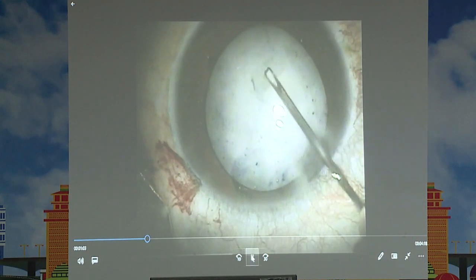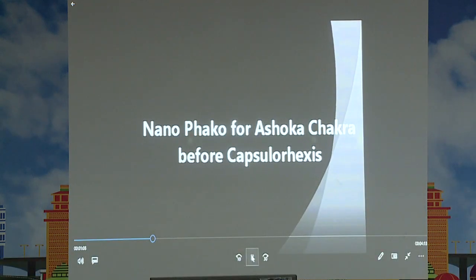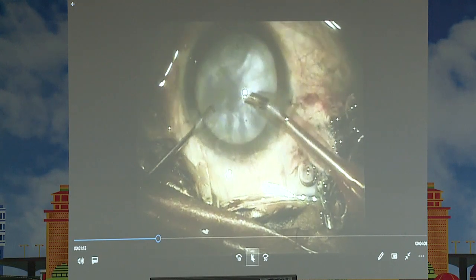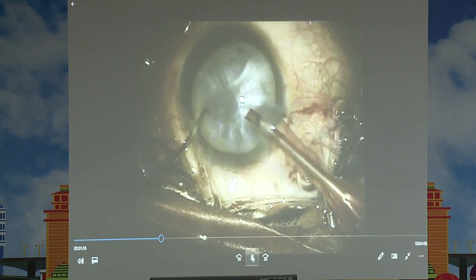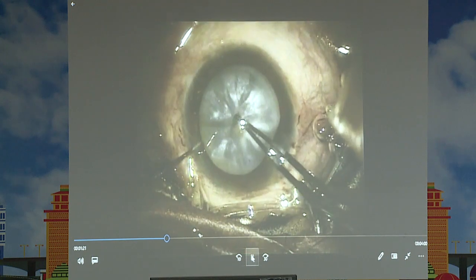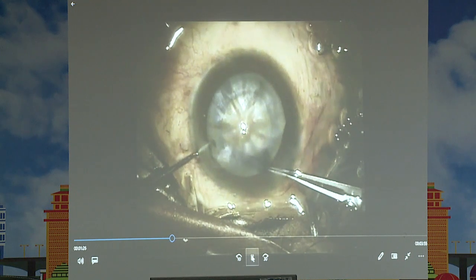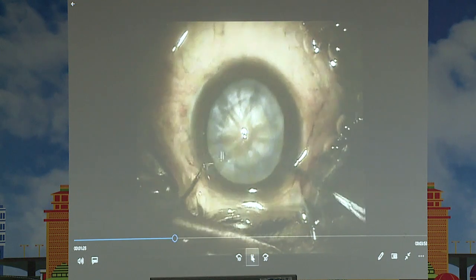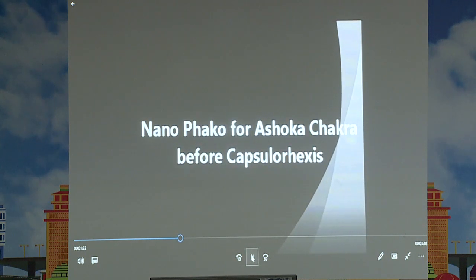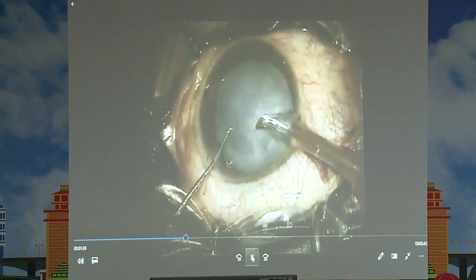You have to have the trypan blue. Another case. Give a punch. You don't have to come out immediately. In the last two clippings, I'll be sharing more details. So this is the rule rather than the exception. It's not a fluke. It goes on very well.